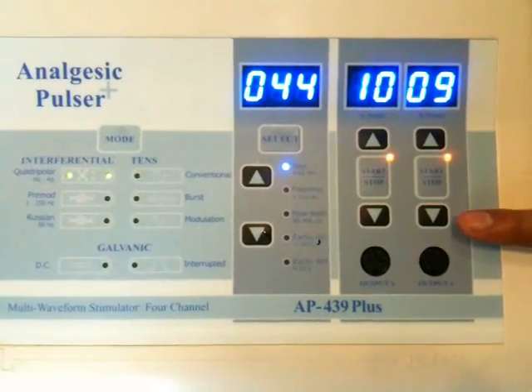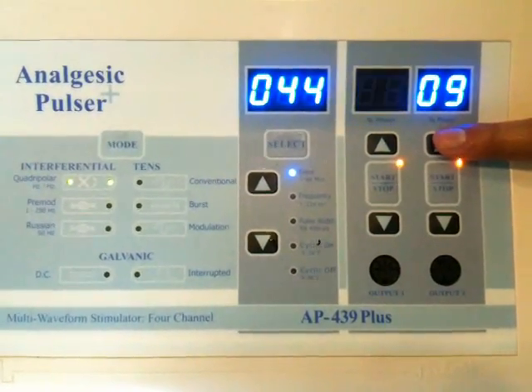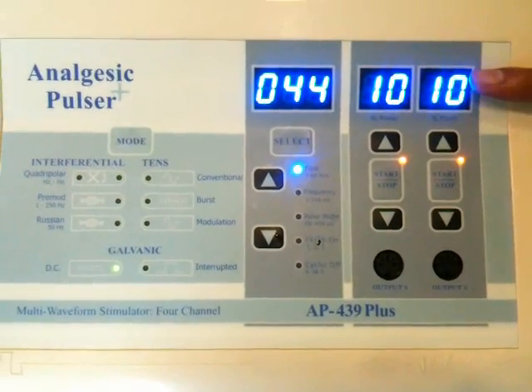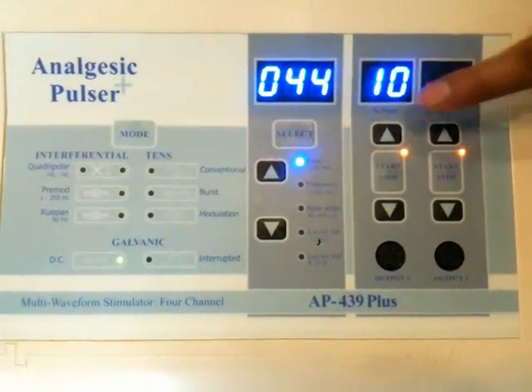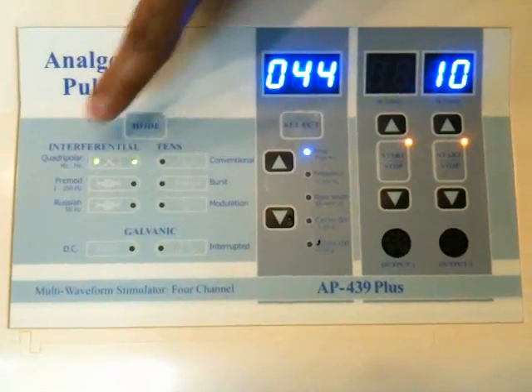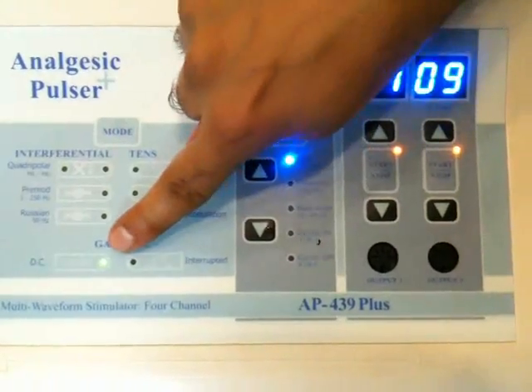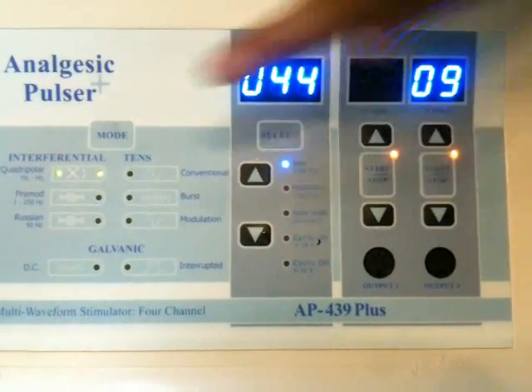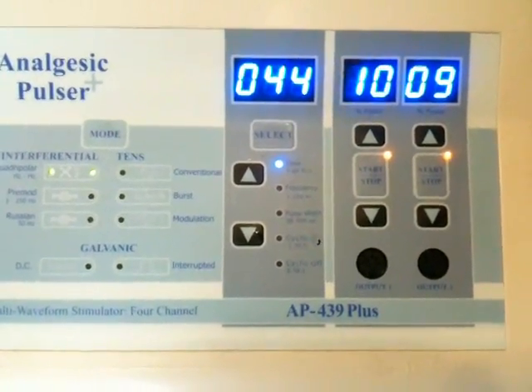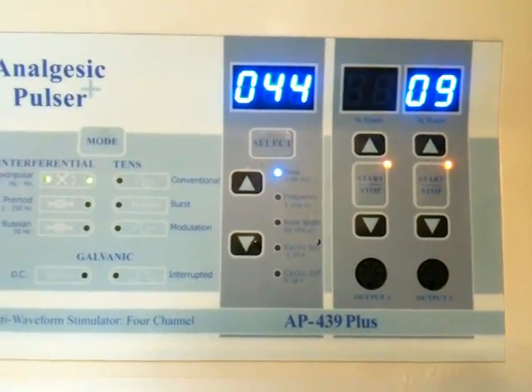Now if we are selecting channel 1, it's showing the mode with LED display. Here it's showing on this channel: Galvanic DC. Here is Interferential, and here is Galvanic.